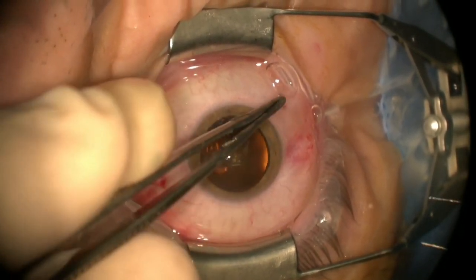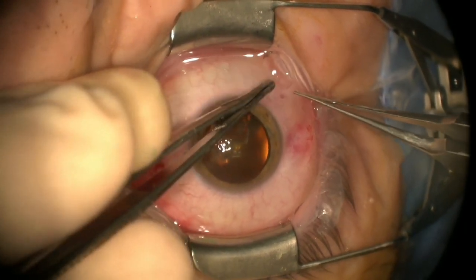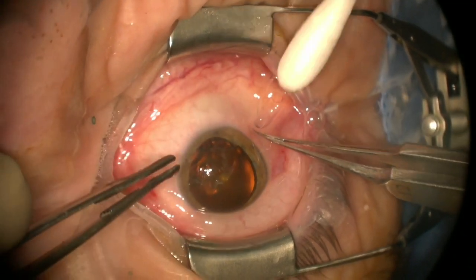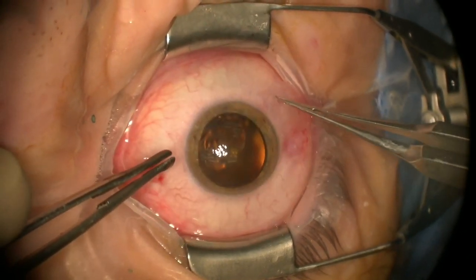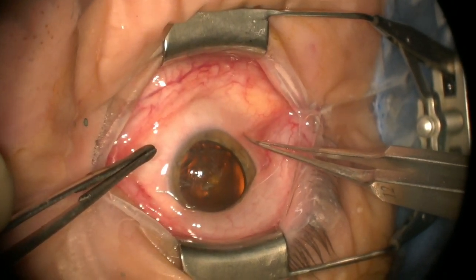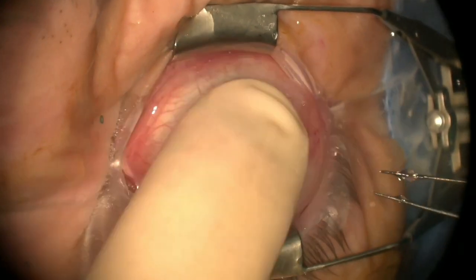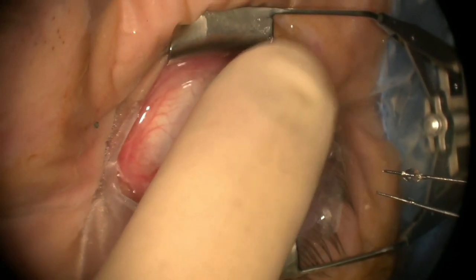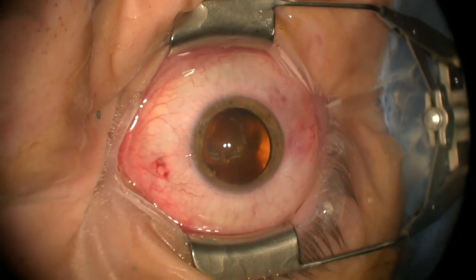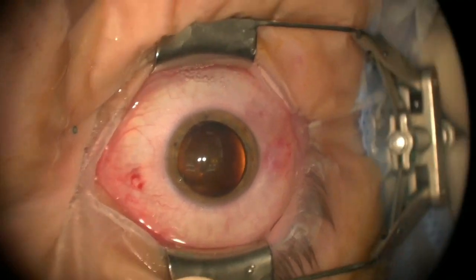And again, we'll take a look at where the wound's at. It's right there. Look how the conjunctiva is displaced so that the wounds don't line up. That's always nice. I'm going to collapse that tunnel. You can press pretty hard. I would not be afraid to press hard over these tunnels to the point where it makes almost a black mark. And of course, we'll check the pressure with my trusty finger. And it says about 15. And we are set. Very good.